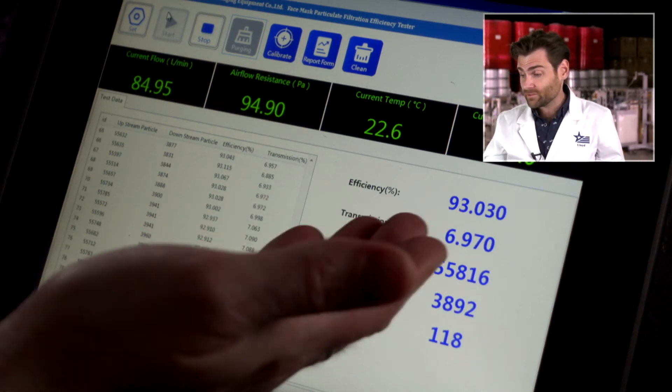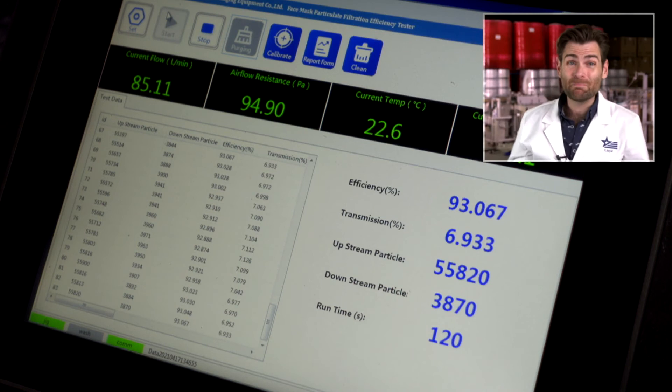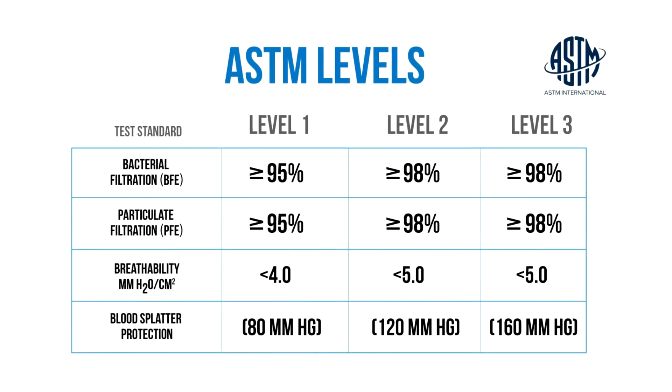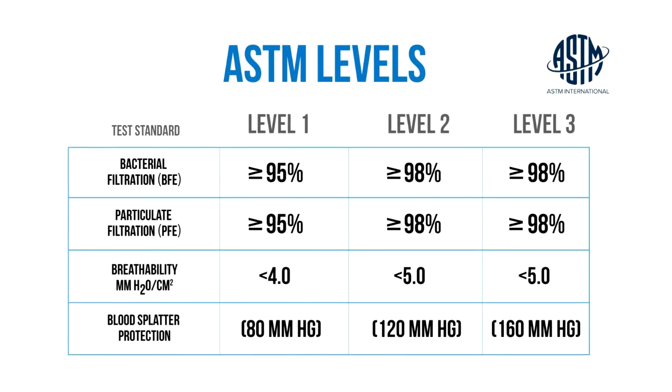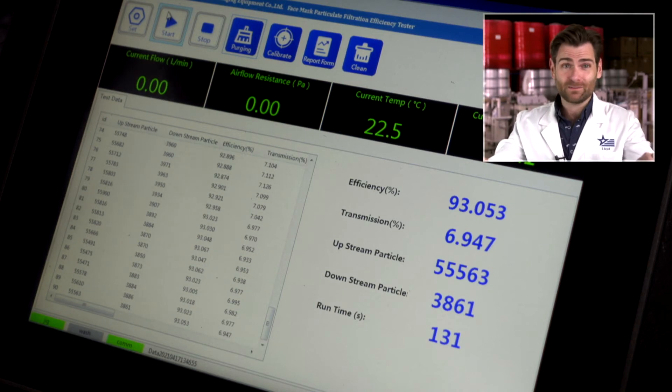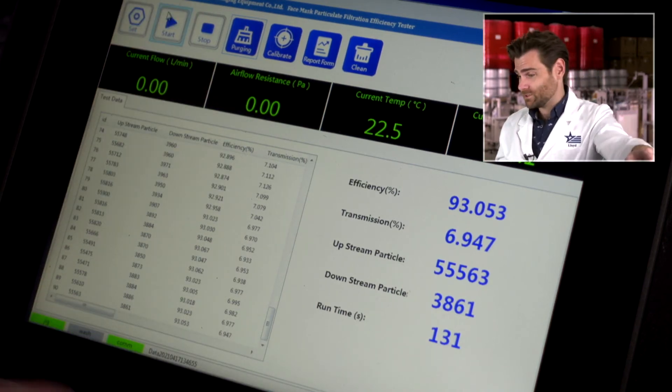Breathability 94 to 95. The efficiency is coming in at 93%. In the United States, the minimum standard is 95% — ASTM level one is 95%, and ASTM level three is 98%. This is a particulate filtration efficiency machine and it's coming in at 93%, which is below standard. I would never wear this mask. That said, 93% with really good construction and no smell — I'm gonna give the value four stars.